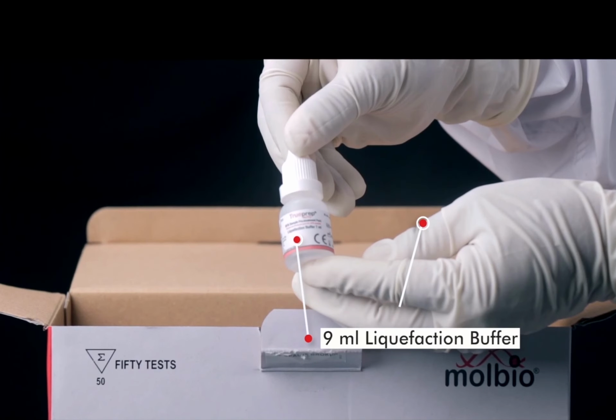Then you have liquefaction buffer. Here you get 9 ml of liquefaction buffer. For 50 tests, only one bottle of 9 ml liquefaction buffer is there. There are two times where you will be using this in your workflow process. In total, per test you will be using 4 drops. Only that much you have to use, then only it will last for these 50 tests. If you pour more drops, then it won't last, and the rest of the kit will become a waste. They don't provide extra liquefaction buffer.